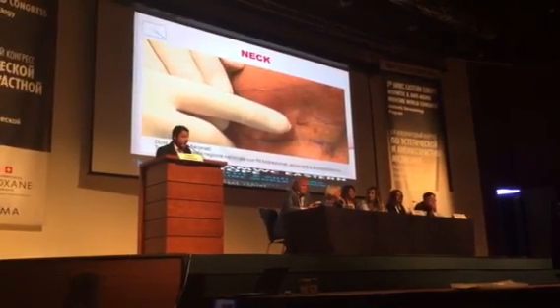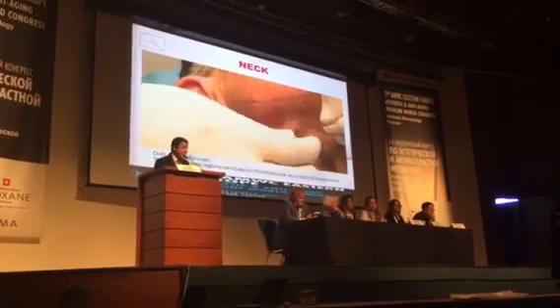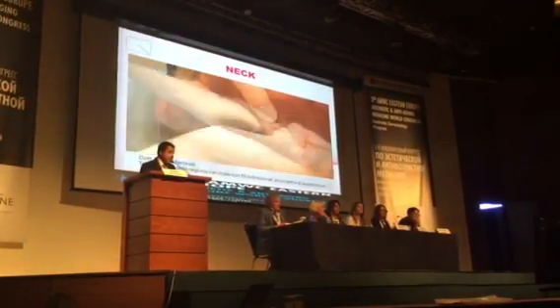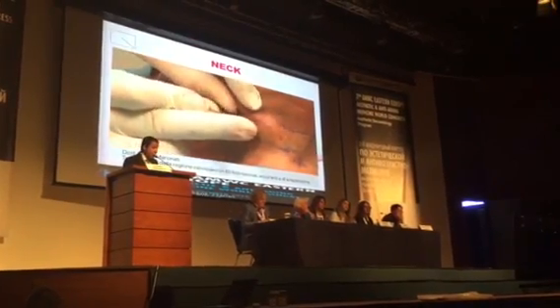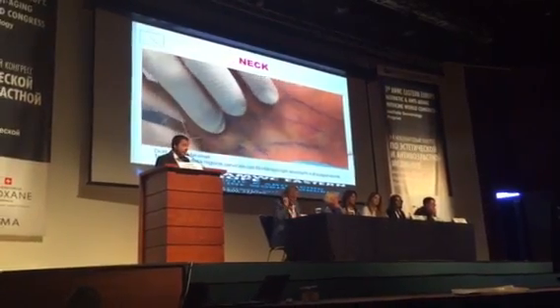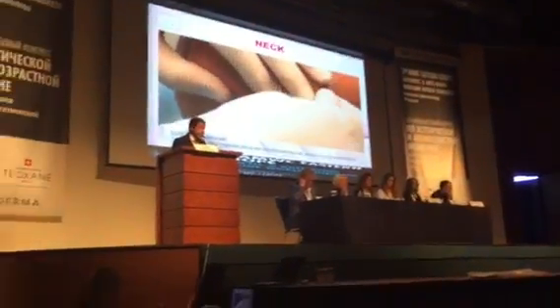Usually when I make this kind of treatment, I start above 1 ear, then I go out more or less at the platysmal band, then I go in and I exit in the other platysmal band. Now I'm making a rotation of 180 degrees because this needle has 2 tips, and I go forward and I exit in the other platysmal bands.